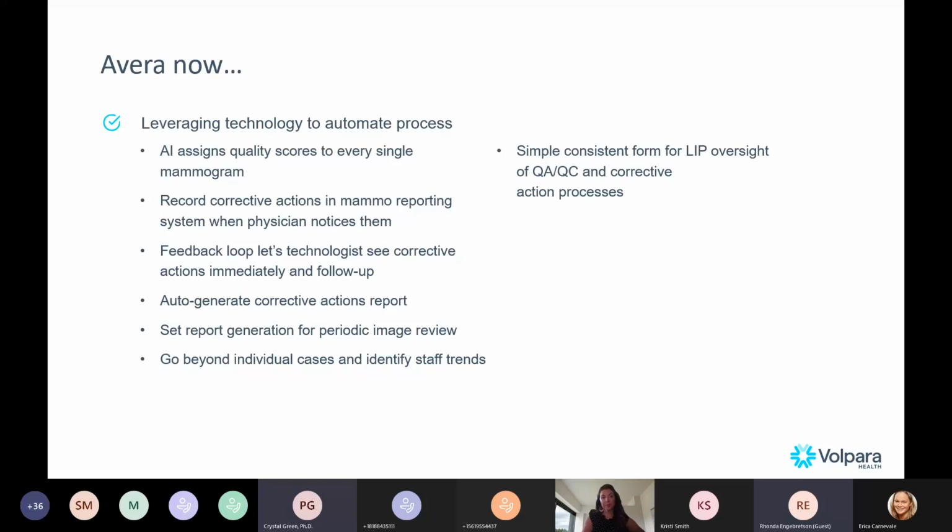But we did identify some positioning issues with a few of our outside sites right shortly after we initiated Equip. And so we were able to get them some additional training. So, yeah, it did a little of both. It did some of the corrective action for them.